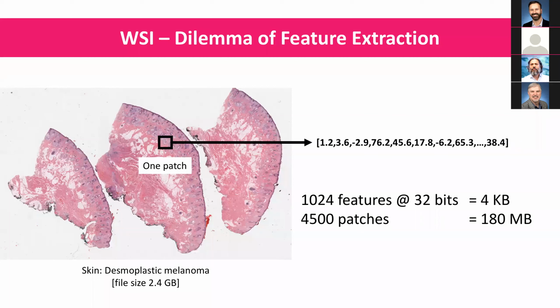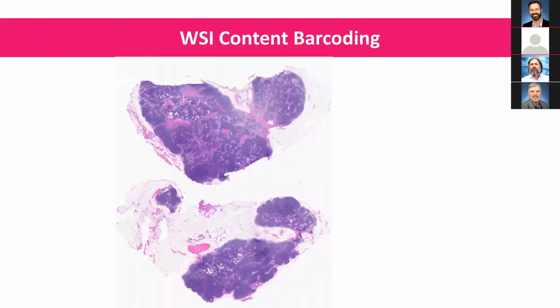And this is compared to 2.4 gigabyte, may not appear too much, but you still have to store this additional information. And no IT department in any hospital would like that you're asking for more storage, and also processing 180 megabyte of information additionally for every whole slide image would be a huge challenge.